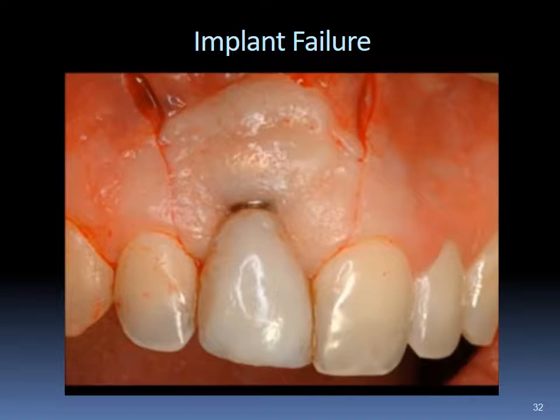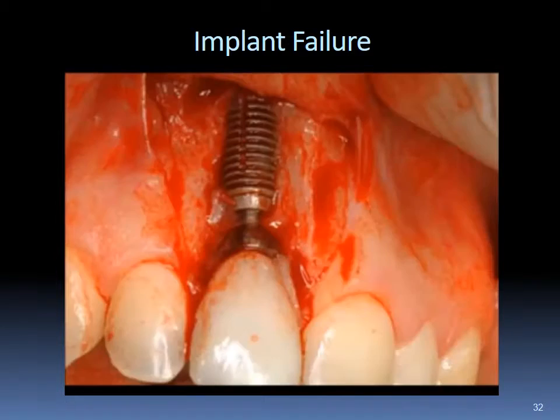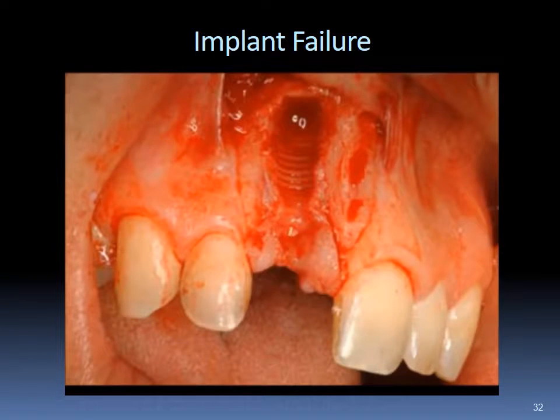into the implant site with vertical incisions and full flap reflection. We removed all of the connective tissue from the facial aspect of the implant, and this revealed the poor relationship of the implant to the bone. It required only moderate force with extraction forceps to dislodge the implant. This force was not much greater than if Robert had bitten into a raw carrot.